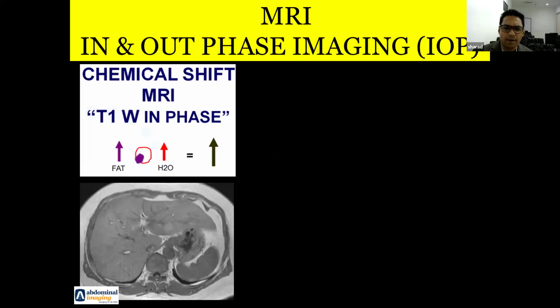Coming to MRI, as you see, there is subcutaneous fat, there is fat in the mesentery and omentum. This all appears bright on the T1 weighted image. So this is the macroscopic fat. But the microscopic fat we cannot see on a routine sequence. Why is it so? On the in phase, the fat and the water are precessing in the same direction, so they add to the signal.